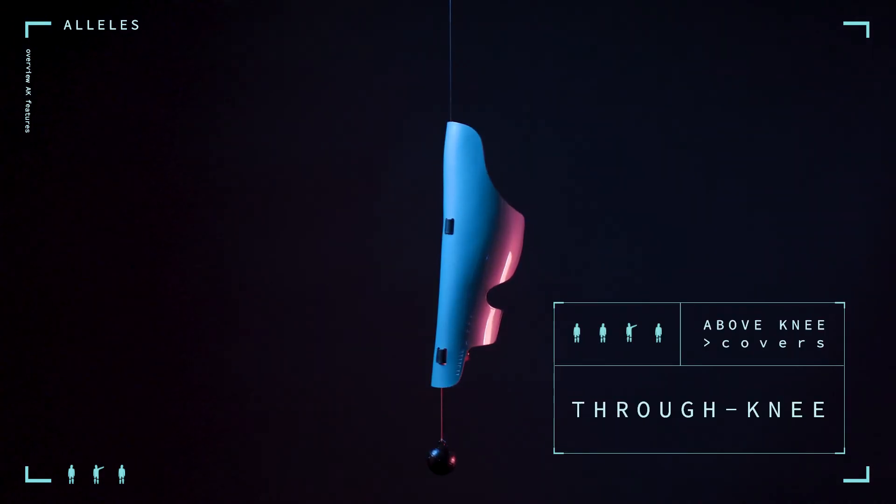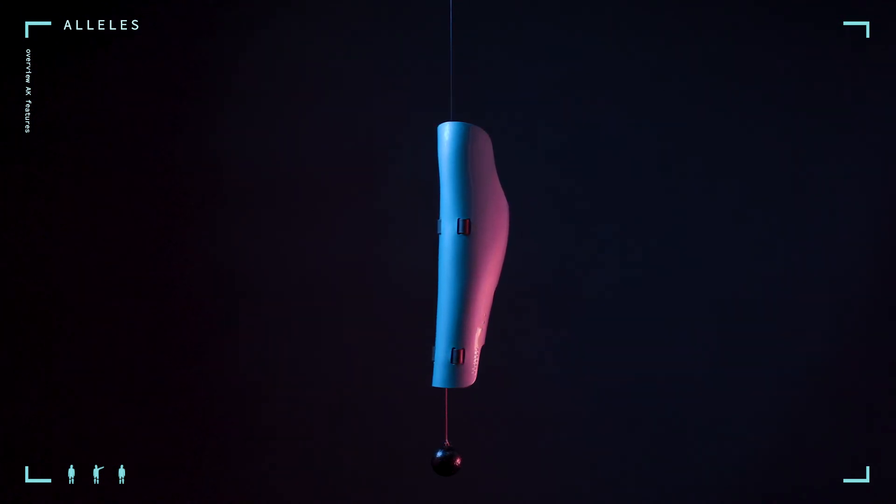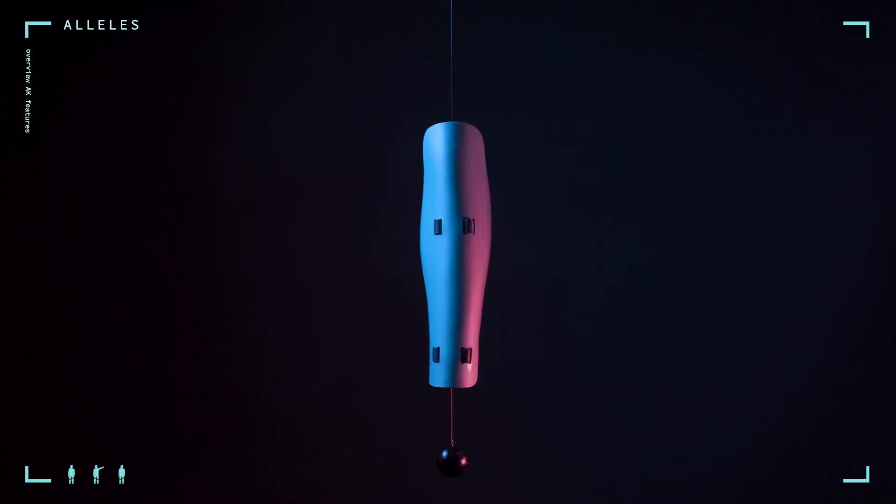Through knee. For a through knee or knee disarticulation patient, we do not require any additional measurements but do require that you communicate this. By selecting that your patient is a through knee, we will adjust the shape of our AK cover to better accommodate the patient's prosthesis.